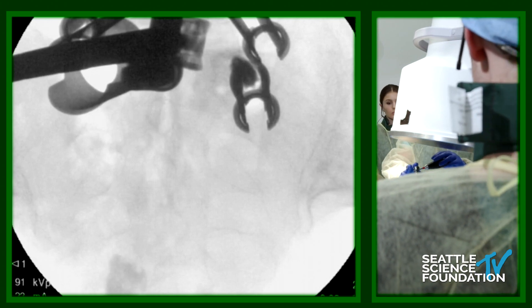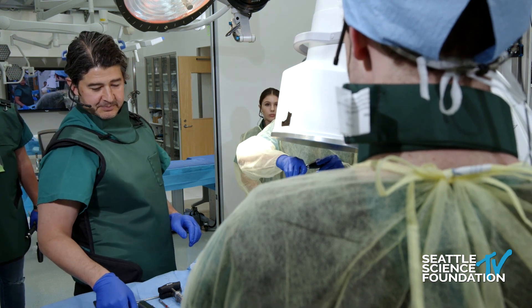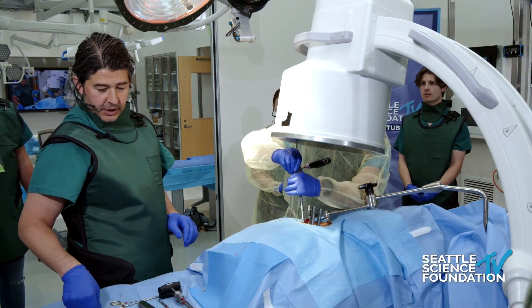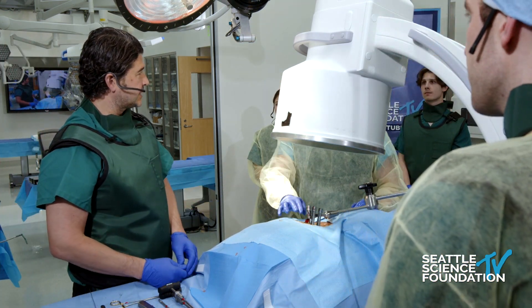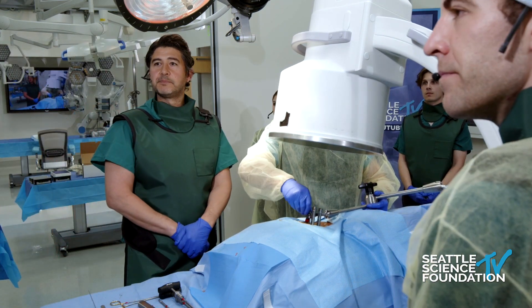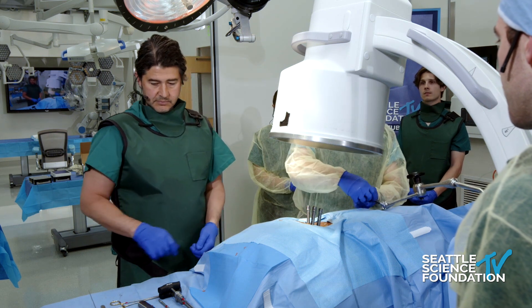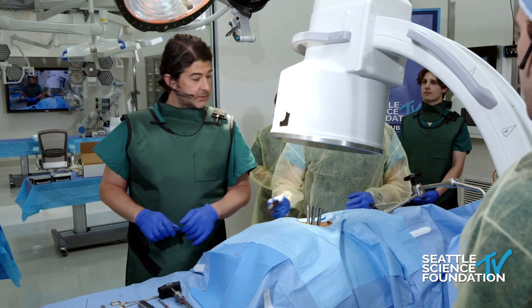Any other questions? That was a five-minute T-LIF. Are you using the microscope because of the lighting, not because of the magnification? Both. I use the microscope even for my decompressions — you can see everything so nicely. For people who don't want to use a microscope, an option is a light attachment you can put on top of the retractor, and you can use a loupe along with the light source as an alternative, so you don't have to crowd the OR with the microscope and the C-arm.